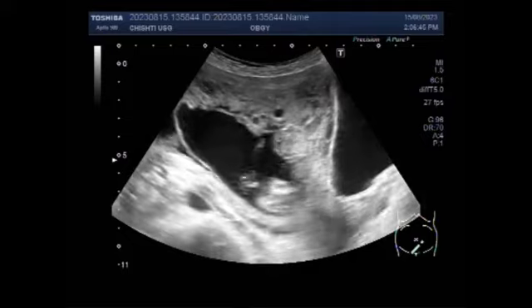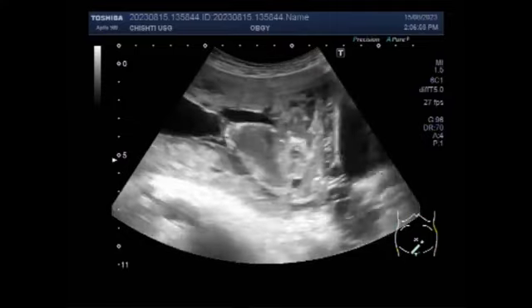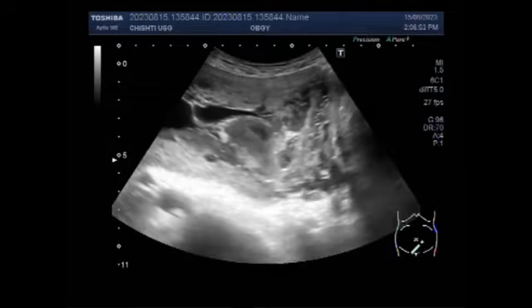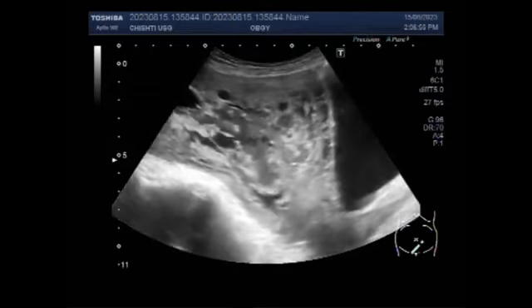Ultrasonographic diagnosis of twin pregnancy with the hydatidiform mole and coexistence fetuses is feasible at the end of first trimester.